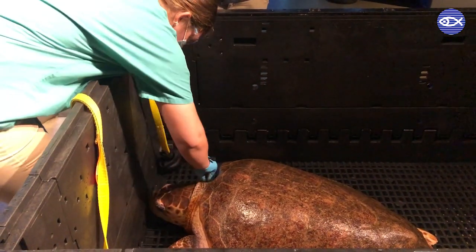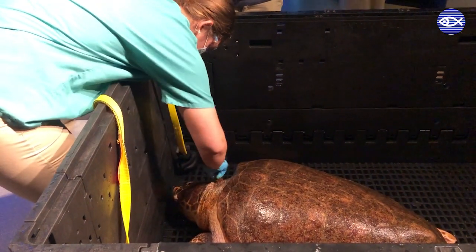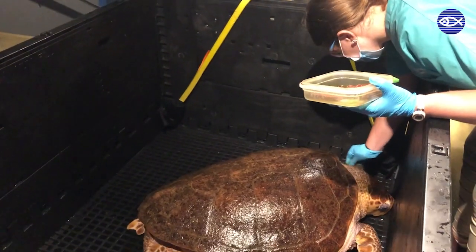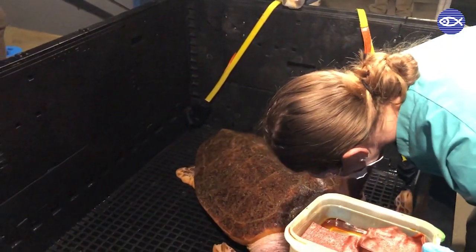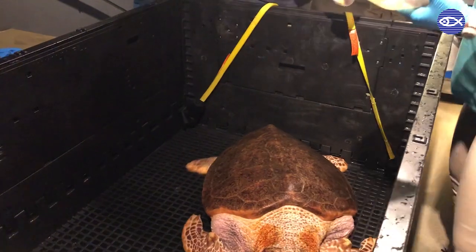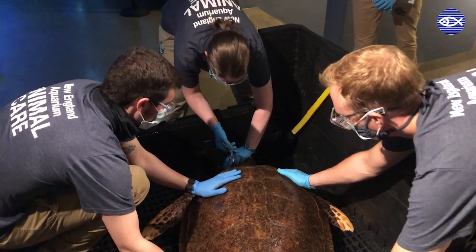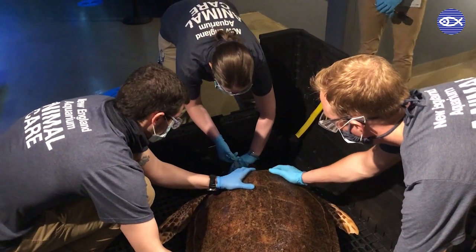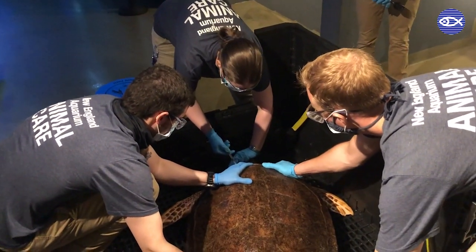Today Carolina is due for a blood draw, physical exam, and ultrasound. Before drawing blood, the vet staff cleans the area with repeated betadine and alcohol swabs. Sea turtle skin is very bumpy and textured, so the repeated sterilization helps to ensure the skin is clean. The blood sample taken today will be sent to the lab and give us a snapshot of her overall health, and the blood values from this year will also be compared to previous samples taken to look for any major changes.